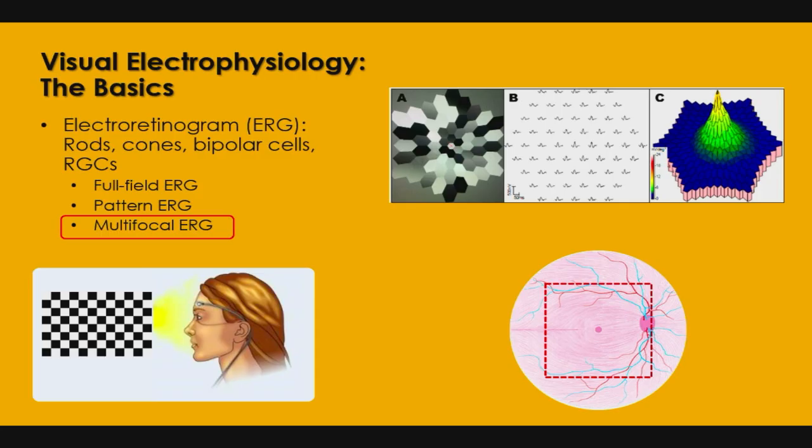I'm curious, does it record fixation losses? Yeah, so we have a big camera that will be looking at you. There are a number of things you can do. Some of the systems are designed to stop taking data when the person looks away. Some have a camera that is focused on your eyes, and the person doing the test can watch to see when you are not fixating. Of course, there are also practical reasons why some people may not be able to fixate. If somebody has a big central scotoma, they can't see that, and so there are other things we ask them to do instead.